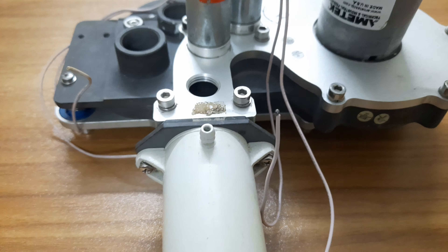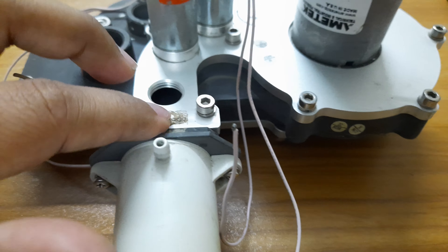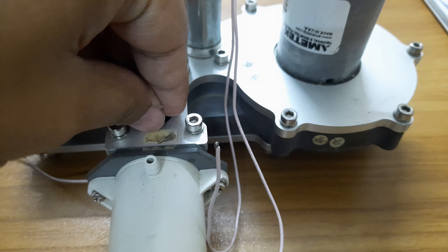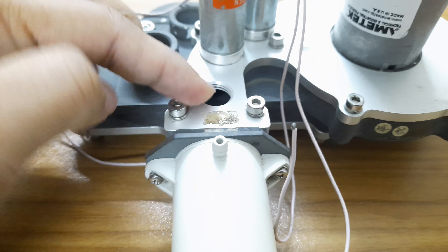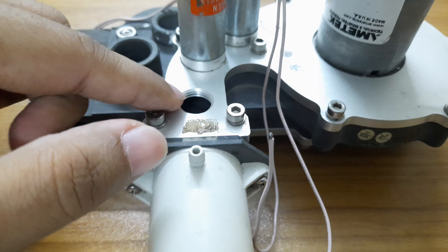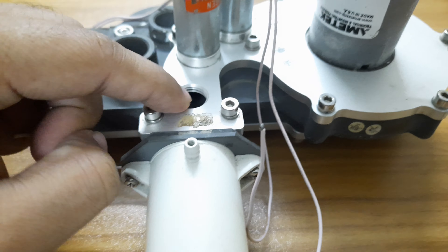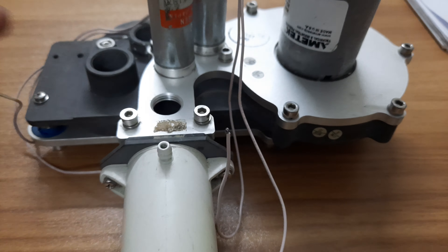This hole is for the oxygen sensor; an oxygen sensor can be connected to this port so that the ventilator can know the oxygen saturation level — the FiO2, which is the fraction of inspired oxygen. This is the basic overview of the Versa ventilator's turbine.